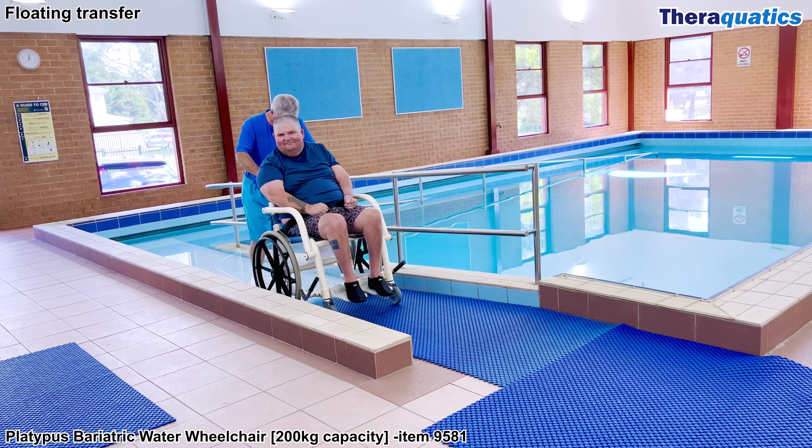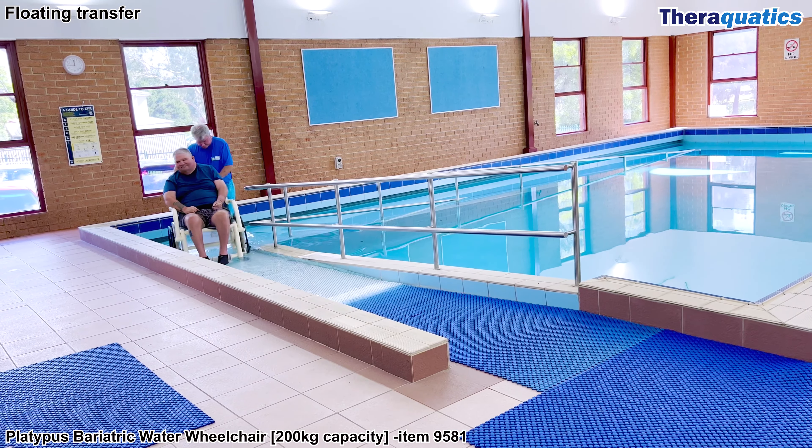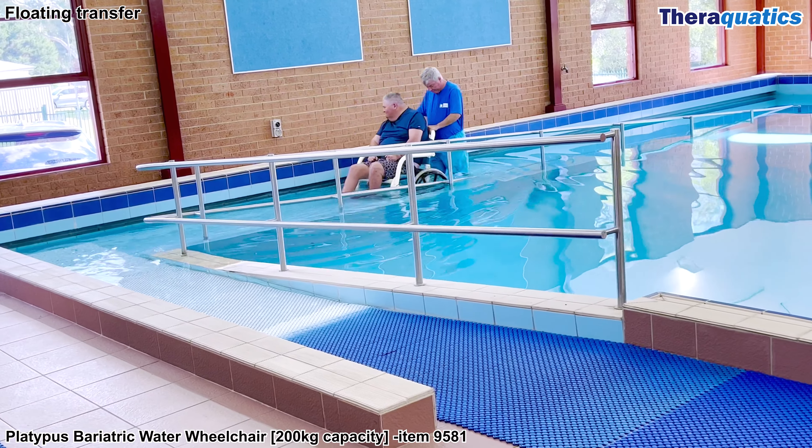Walk the water wheelchair down the ramp backwards to maximise safety. The water wheelchair is lightweight, rust proof and easy to manoeuvre. It has user-operated brakes on each side and a lap belt to ensure safety.